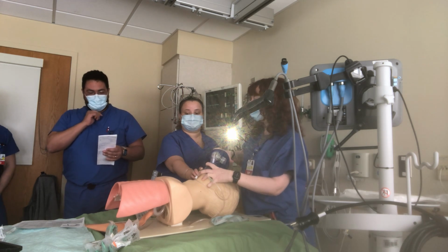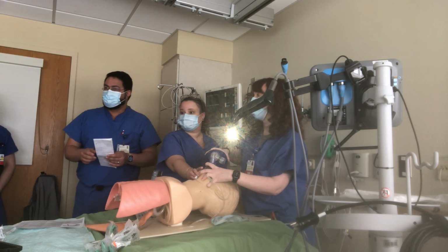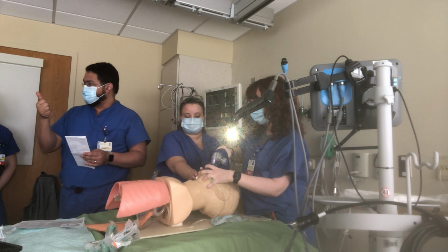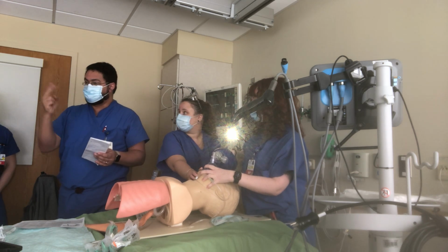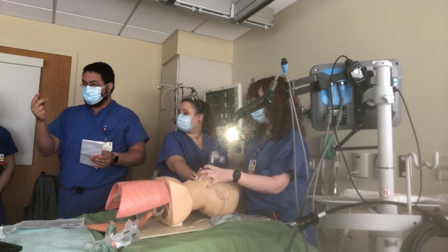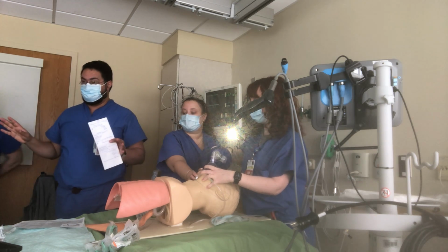Intubating element? Nope, not yet. Think about it. We have 2 bridges that are burned now: the intubation bridge and the mask ventilation bridge. So are you gonna put this patient to sleep and depend on the crike? That'll be your fallback position. The crike is horrible.